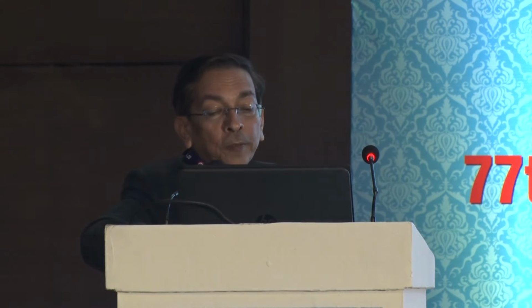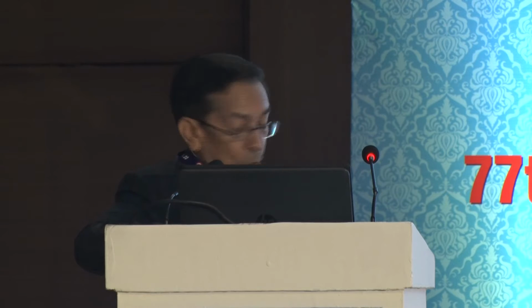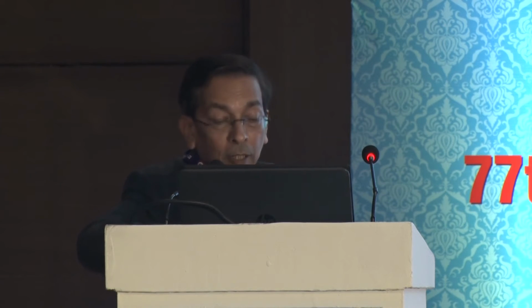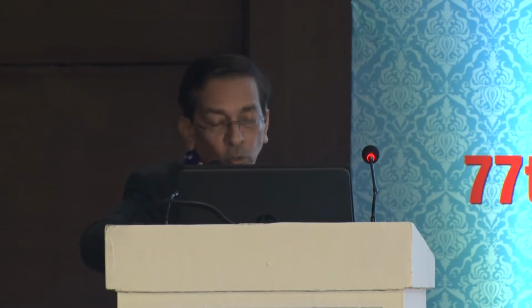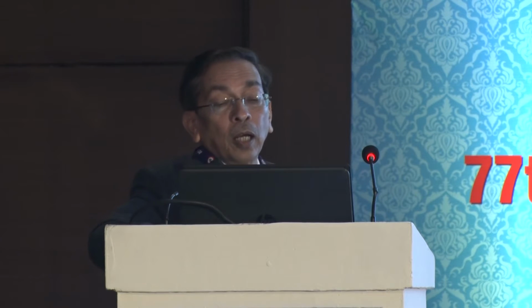We did the rotation, and post-operatively, you see that aberration at 4 mm is quite less. Astigmatism is reduced. It is on the negative side. That's where the blue line indicates. And with 2 mm, all aberration is gone. So with a small pupil of 2 or 3 mm, the aberration is gone. So the patient is comfortable with good vision.